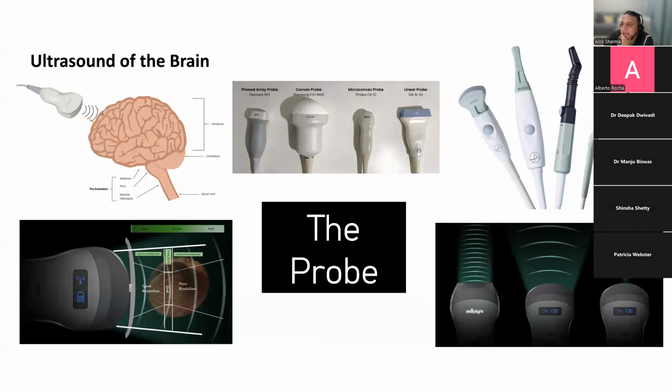If your fontanelle is like this, as opposed to being that wide, then really what is going to happen is that frequency is going to give you penetration where you can only amplify signals based on the region of the fontanelle. Now, some machines have the ability, they've got what is called lateral gain compensation. So not only are you able to amplify images from the depth of the brain, but you can actually amplify images from where the waves are actually going laterally as well. Now, I know for a fact that our GE Vivid doesn't have lateral gain compensation, it just has time gain compensation.